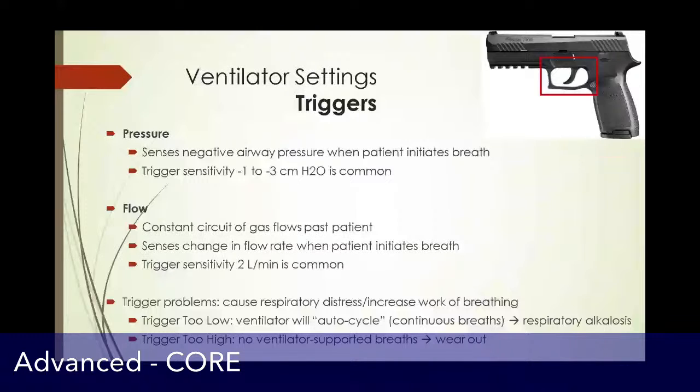Or alternatively, you can have a flow trigger, and in the ventilator you'll have constant gas flowing through the circuit to the patient. And again, basically as you're having a natural inhalation, you'll have a change in the flow rate, and that will trigger the breath.